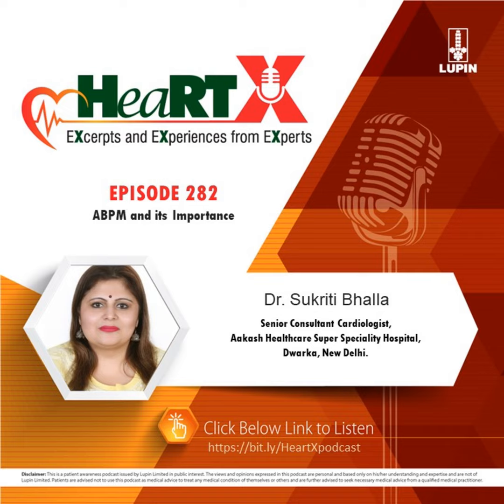Usually, there are not many disadvantages, but yes, it can be a little more expensive, sometimes has limited availability, and sometimes can be uncomfortable for a blood pressure device to be worn for 24 hours. Ambulatory BP monitoring is an indispensable tool in diagnosis and management of hypertension and its therapy. The recent guidelines from ESC recommend that the diagnosis of hypertension should be based on repeated office BP measurements or ambulatory BP monitoring if economically feasible.